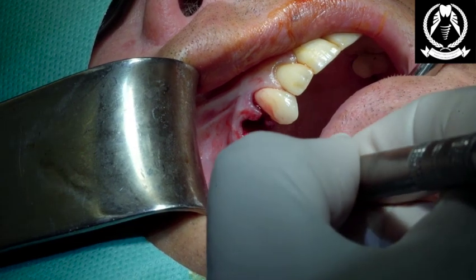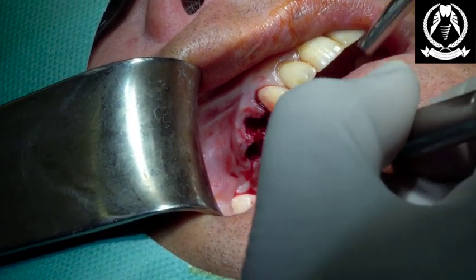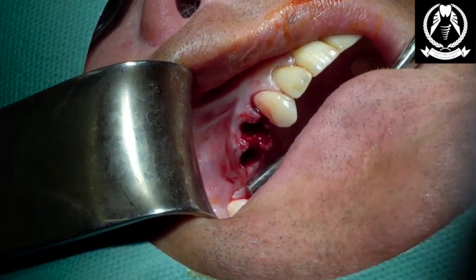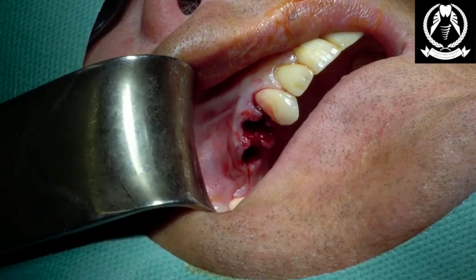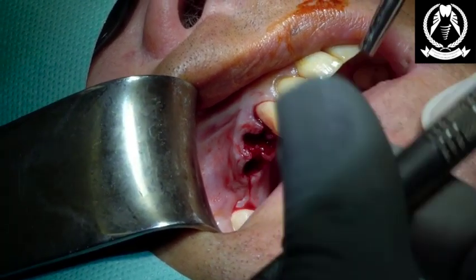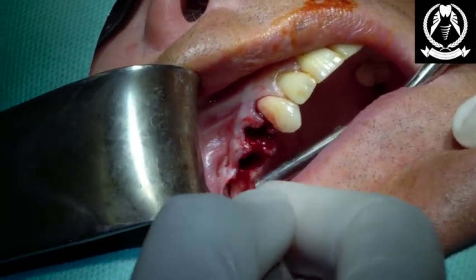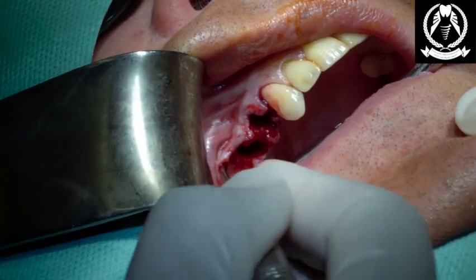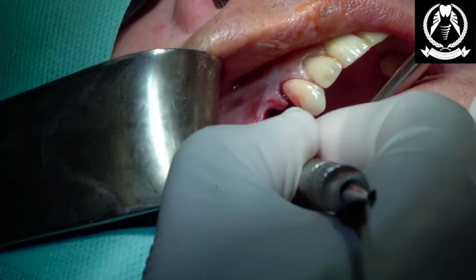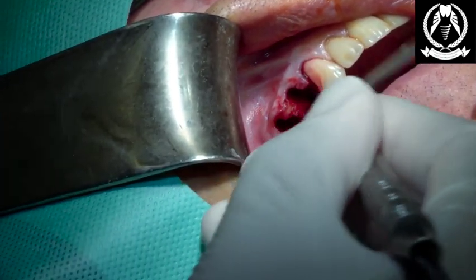I don't like the relieving too much yet until I feel how the tissues are actually going to come off and give me the view that I need. What I'm using now is the AD Blackline kit by a company called Titan. The kit was designed by myself. Very nice periosteal elevators. A bit of pressure, Alan, and expose that bone. Exposing the palatal side quite simply that way.